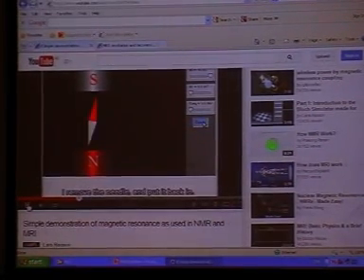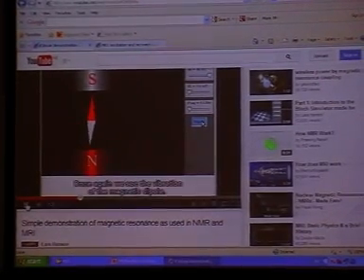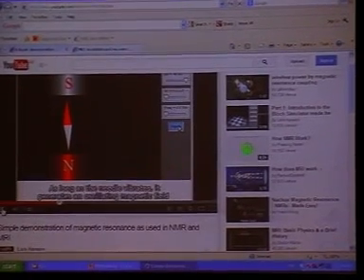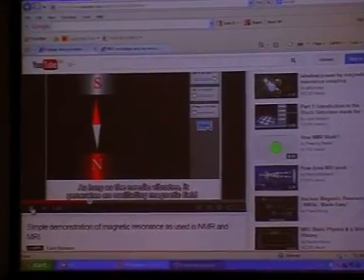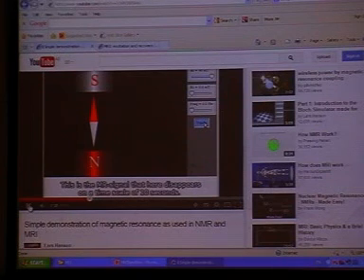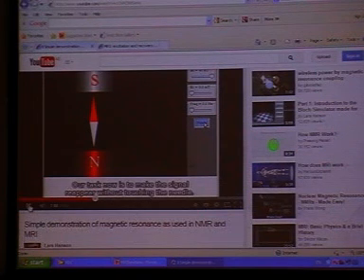I remove the needle and put it back in. So far, once again, we see the vibration of the magnetic dipole. As long as the needle vibrates, it generates an oscillating magnetic field that we can detect with a coil. This is the MR signal that here disappears on a timescale of 10 seconds. Our task now is to make the signal reappear without touching the needle.